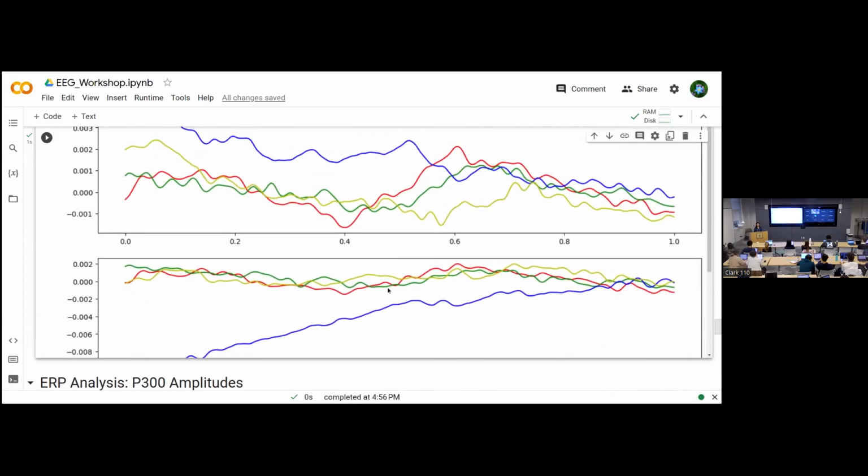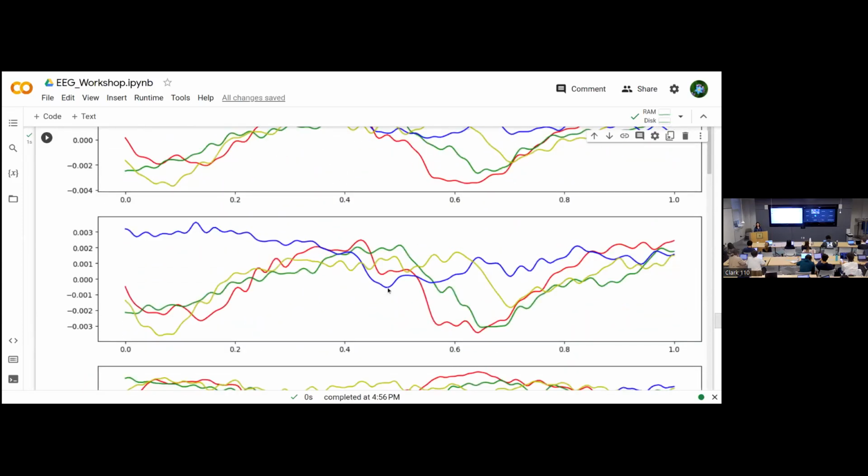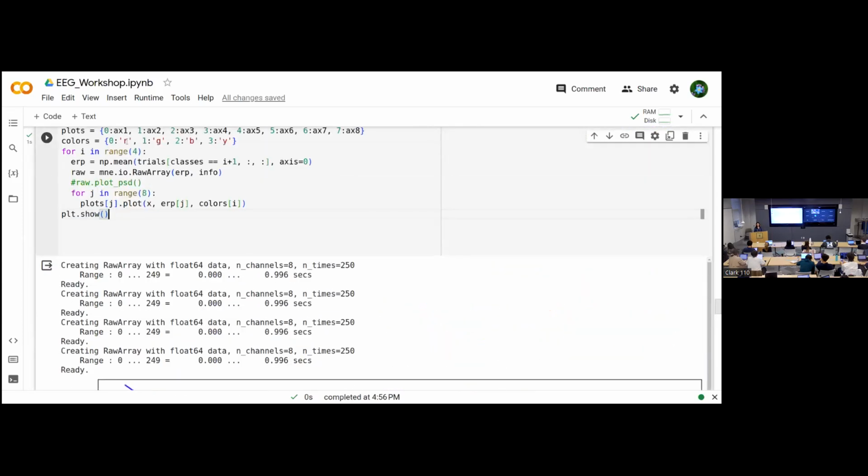And then the color coding is here. The 4 cards each have a distinct color. So in case you want.